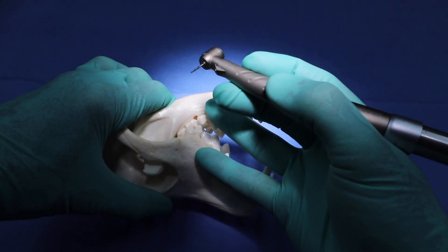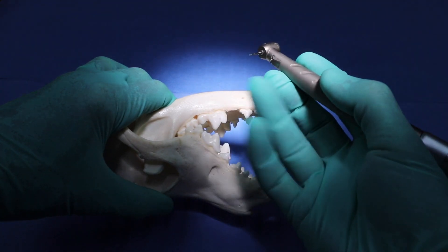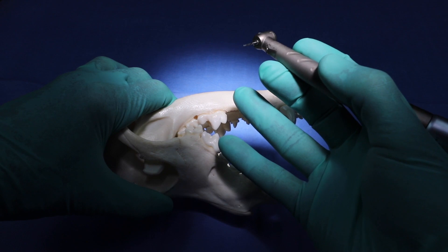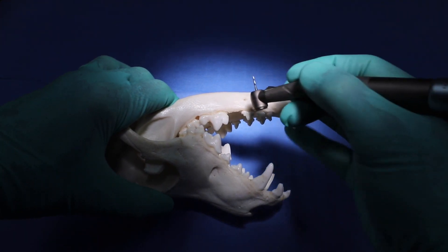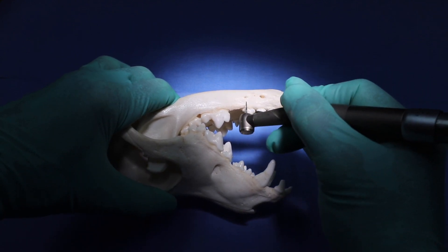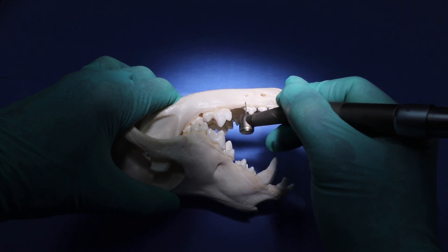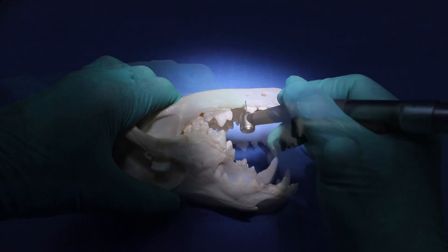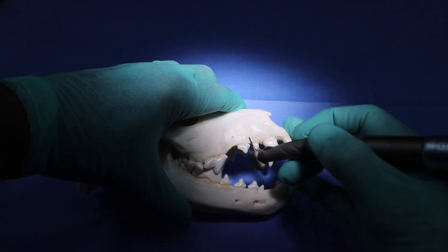When holding the handpiece for oral surgery in veterinary dentistry, this is the proper orientation. You see how it's in the web between the thumb and the forefinger — those two fingers are going to be free to use against the patient to leverage your stability, so that you can use your fingers to move the burr back and forth over the bone and to do your sectioning. Extremely efficient.